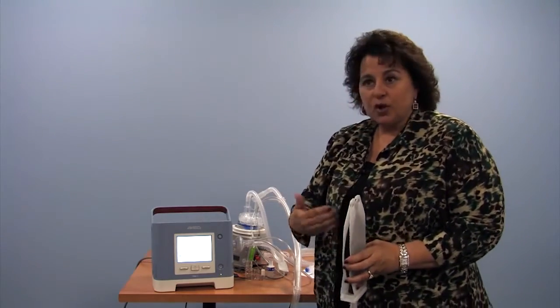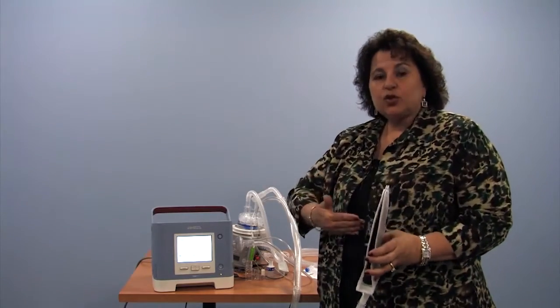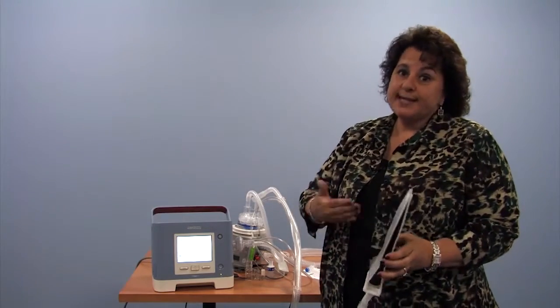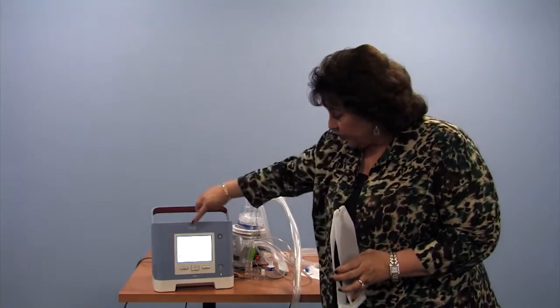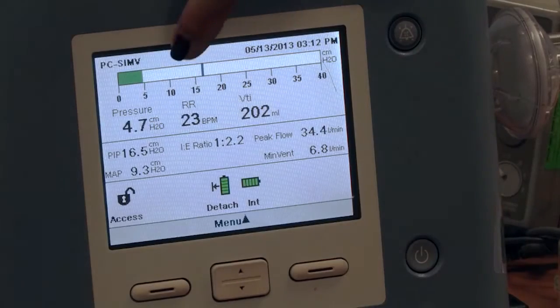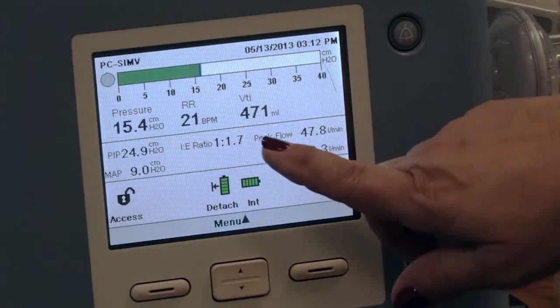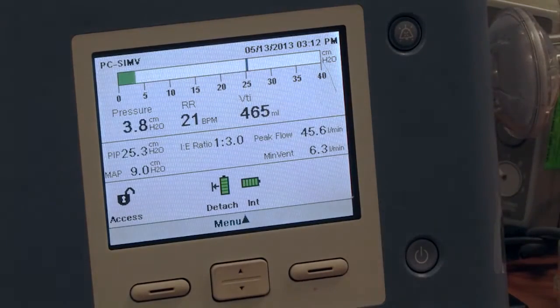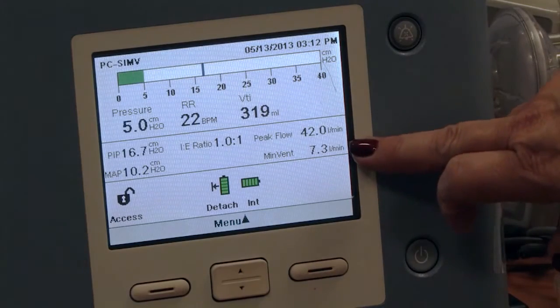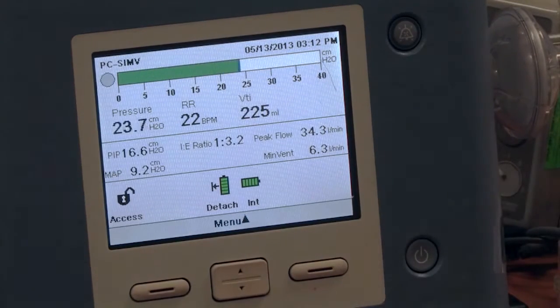And that's something you can also discuss with your physician. If you feel that your child should be triggering a breath but isn't, or did last week and doesn't now, that's something else to look at. So we see the trigger of the breath, we see the pressures that that breath generates, we see the tidal volume or the amount of air that comes out of that breath. We see how much air in a minute that child is utilizing for their life at that time.